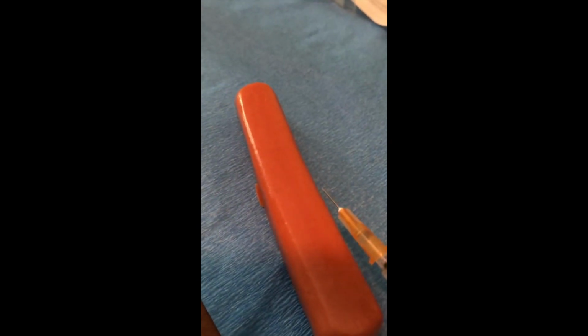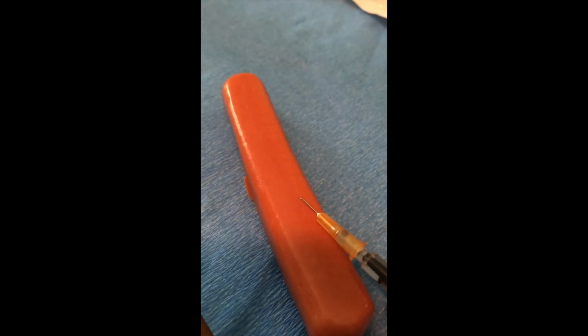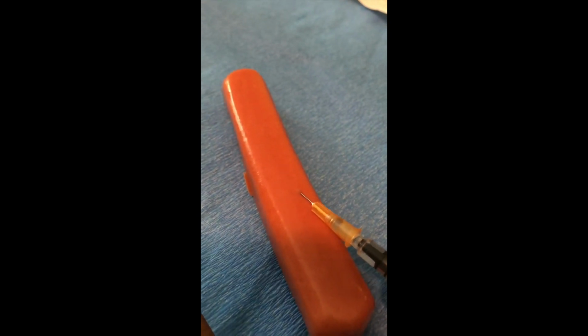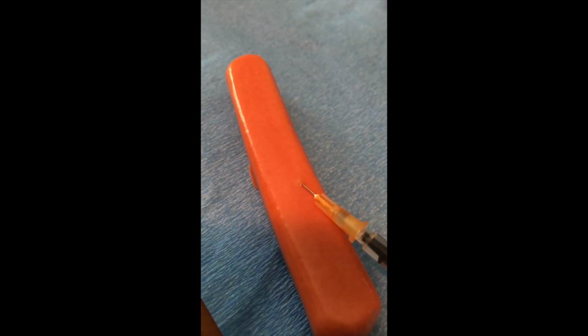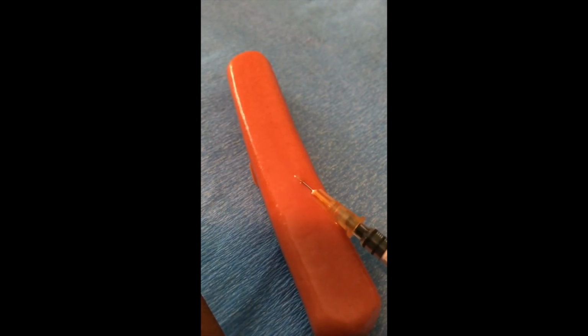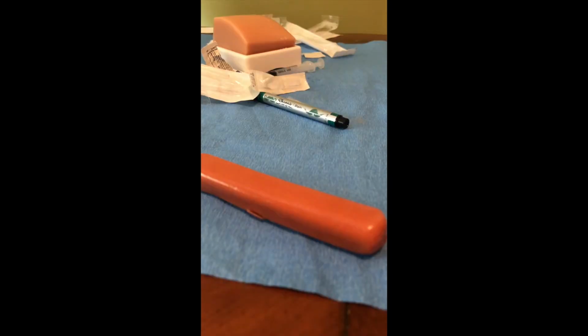Now with this, we're barely going under the first layer of skin. So, and we're not going down at any angle. Just want to make sure that we have covered the bevel. And we want to create a bubble, which didn't happen. Okay, so now I have 2 hands.